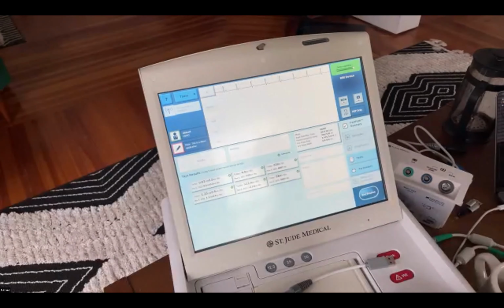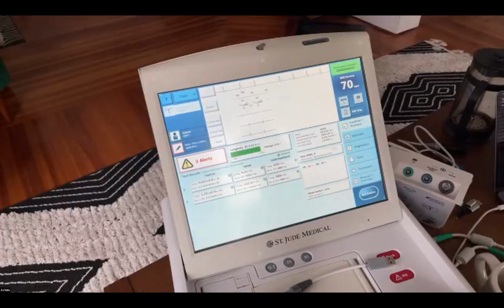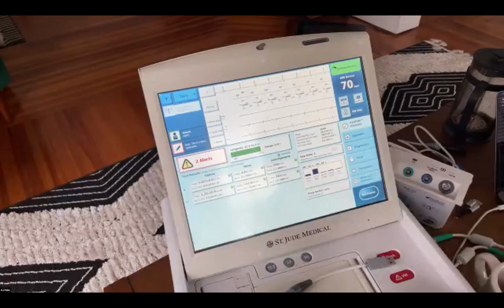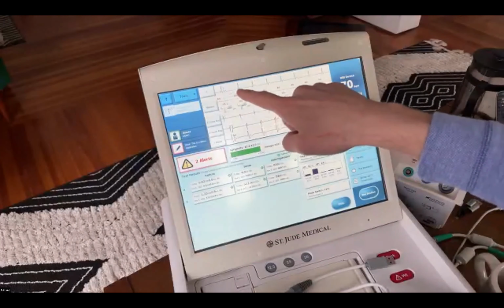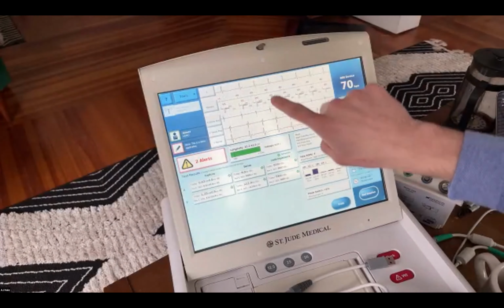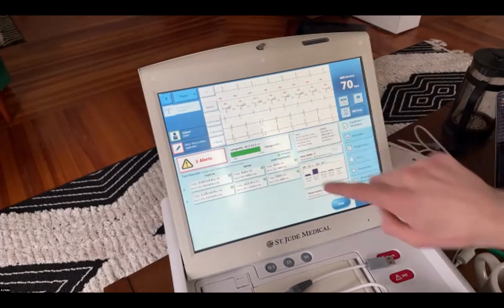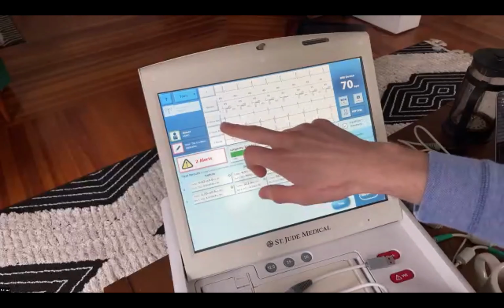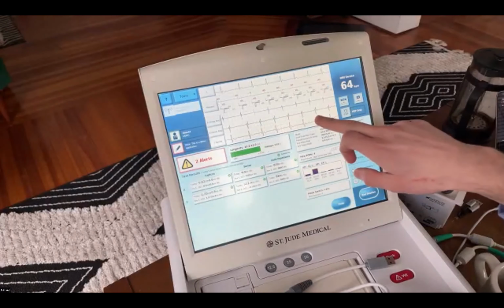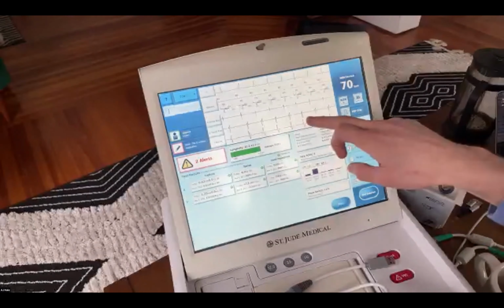So here our demo has pulled up. In this case, it says RF telemetry is enabled. That's because in this scenario, this is actually already plugged into this patient. That's how we're communicating. On the top here, you'll see the 2-lead EKG on lead 2. You'll have your marker channel, A-sense and V-sense. Right here is what's currently happening. You'll have a sense amp channel. This is the atrial sense amp, a V-sense amp channel, and a bipolar channel.